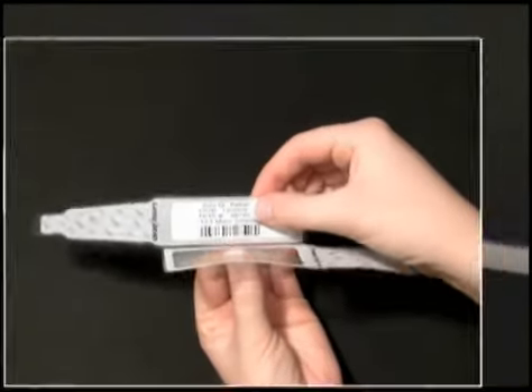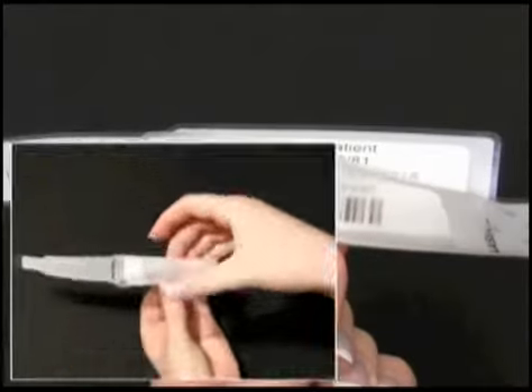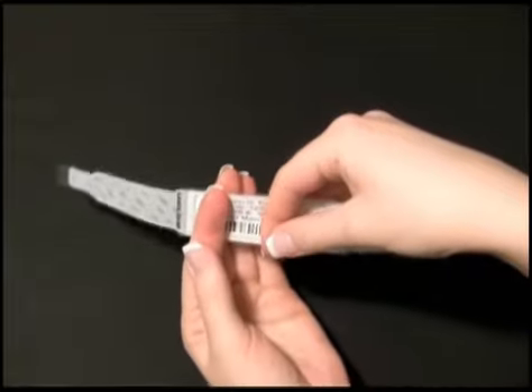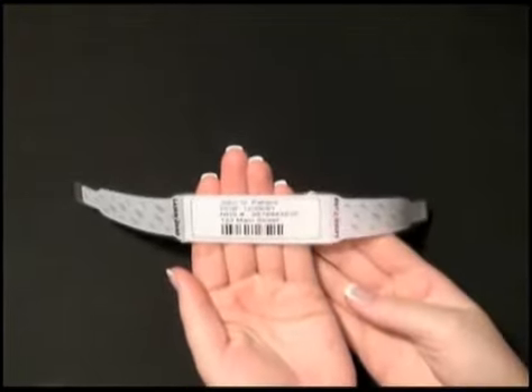Next, create a V by pinching the perforation between the image area and laminate window. Smooth across to create the water, alcohol, and solvent-resistant seal. Set the wristband aside with the blue adhesive tab covering face down.